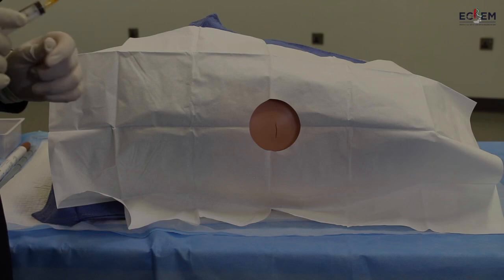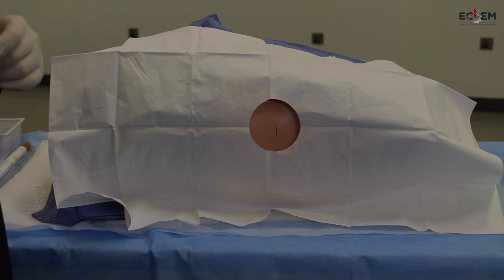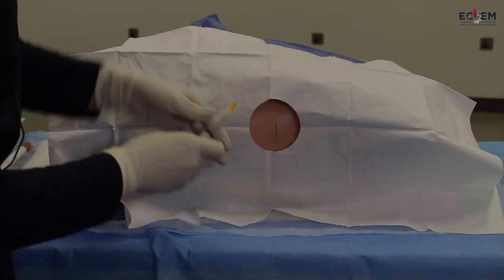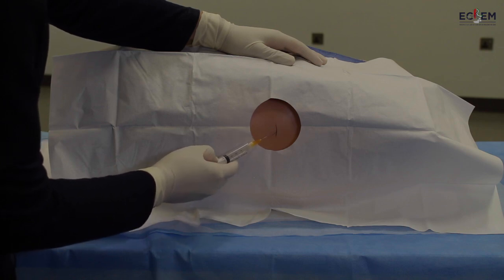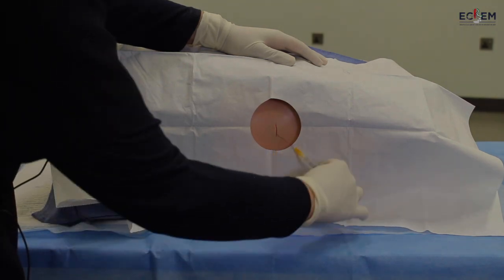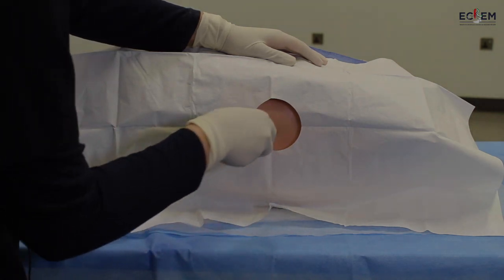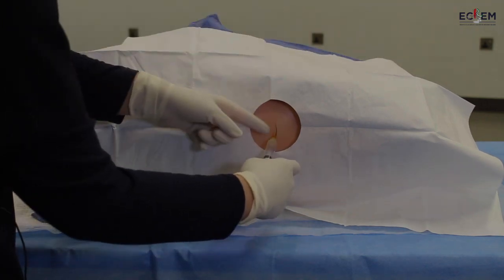This is a very painful procedure, so we have to optimize the patient with local and systemic analgesia. With lidocaine, I go to the skin, make a wheal, aspirate, put 2 ml around the area, aspirate, and push in. Then I go to the deeper surfaces and deeper muscles until I reach the pleural space, where I aspirate and will see fluid or air coming out.